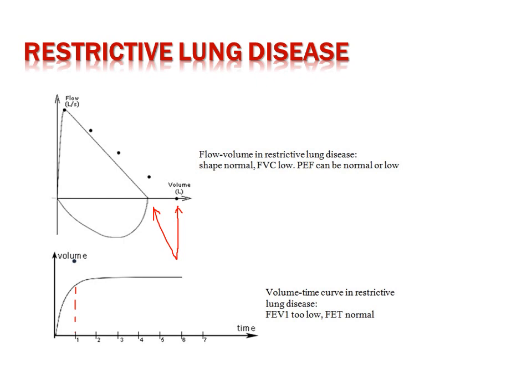Also, for the recording of the flow in the first second, the patient can reach 80% of his expiration within the first second, as in a normal person.